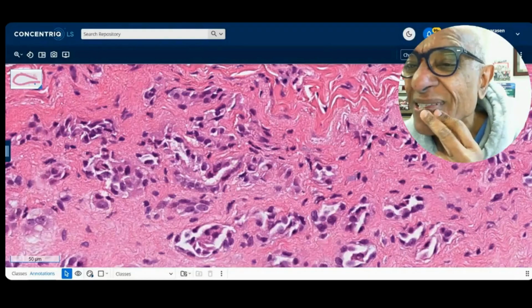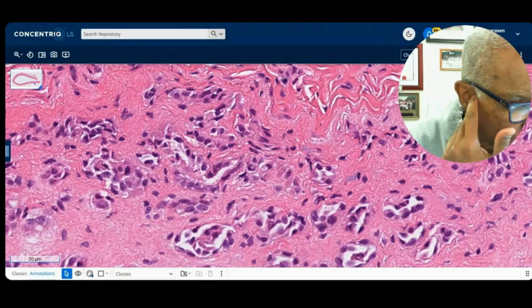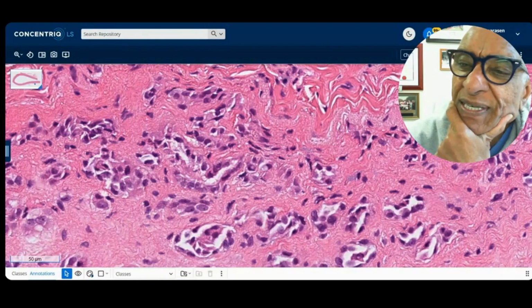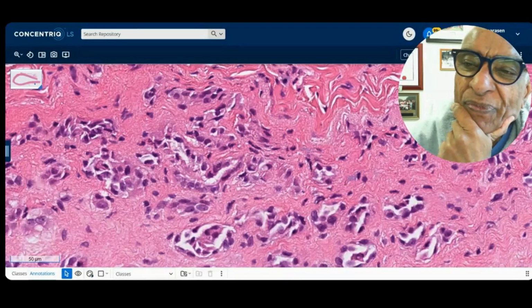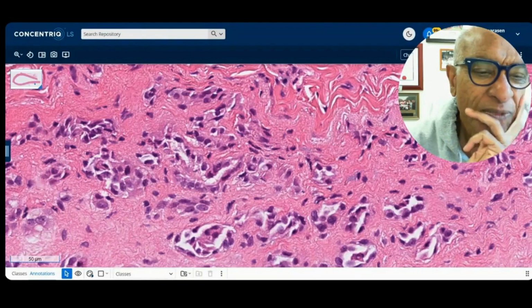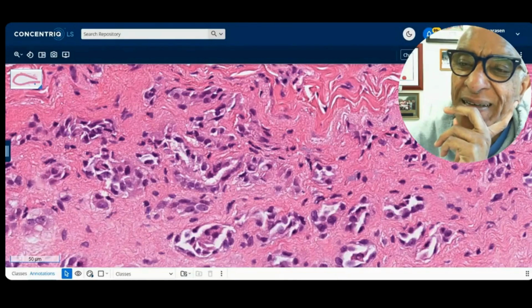Okay, paraganglion cells. Paraganglia usually have much more abundant cytoplasm, large nucleus, prominent nucleolus, and those can occur at this site. If you wanted to do stains for that, you could go ahead and show that they're all negative for paraganglion cells. That was Premila.